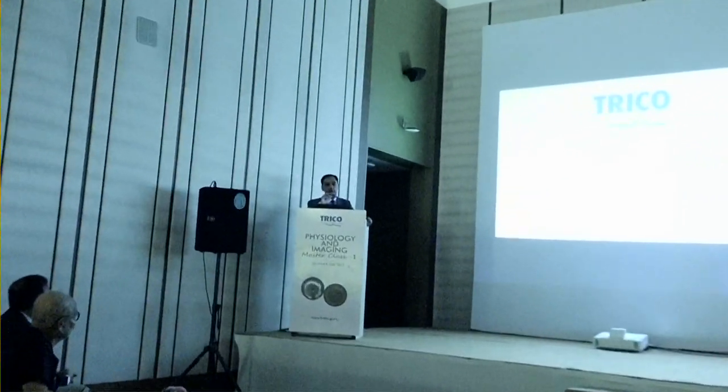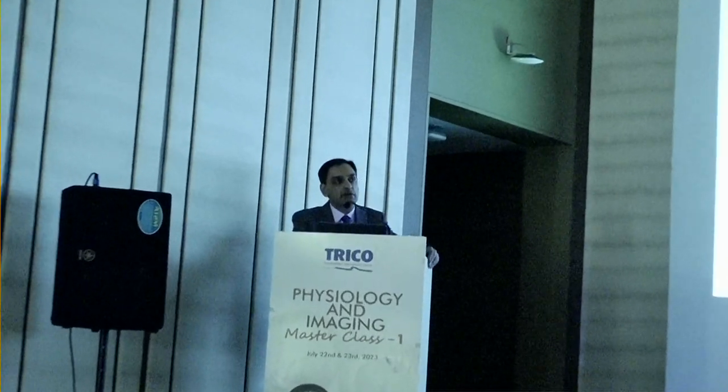Yes. Well, we'll cover that tomorrow, but I think generally we've gone towards non-hyperemic, mostly because of convenience and speed. For the first few years that we did iFR, we would do both. And once we got comfortable that we were really seeing similar data, we switched to doing iFR. Should we do both? I tend to do both whenever I think I need both data, but there is no systematic way where I'm doing both. We've really switched mostly to iFR now.